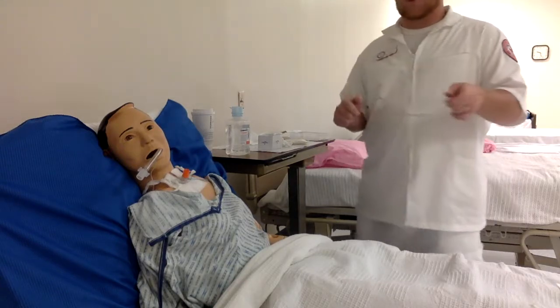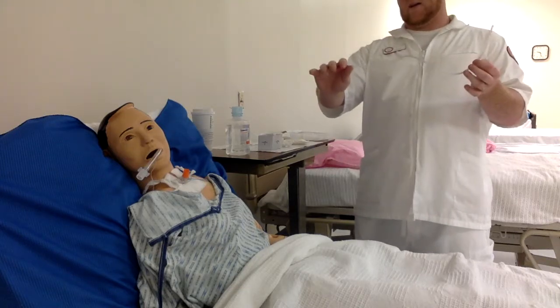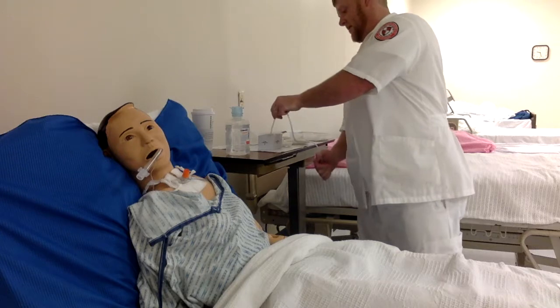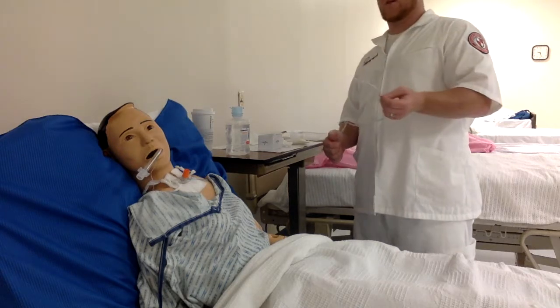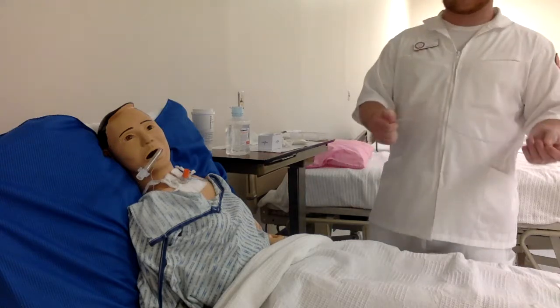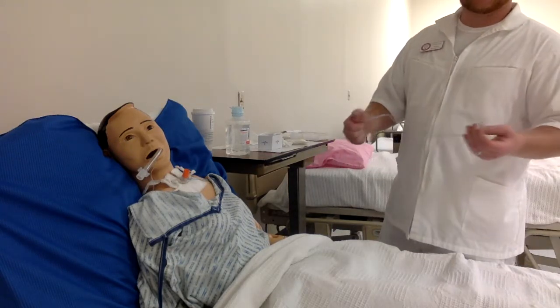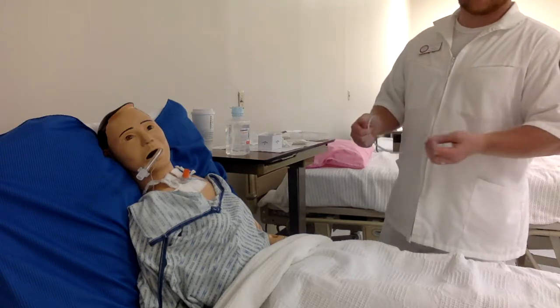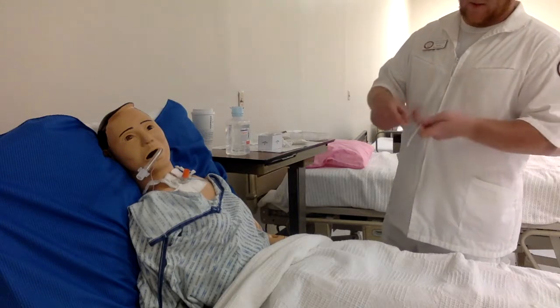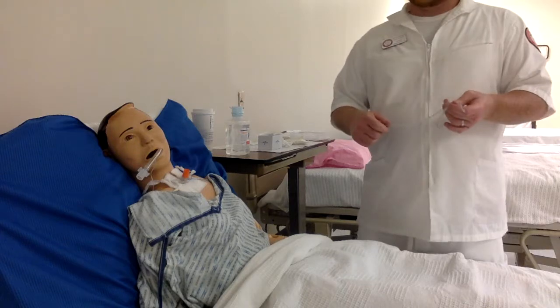You obviously don't want to jump straight in without testing it first. Take the catheter — with your sterile hand — and stick it in the saline. Make sure that it suctions through by pulsating. If you hold your finger on the port it's going to suction, and if you don't, it won't. That's how you confirm the suction device is working correctly.